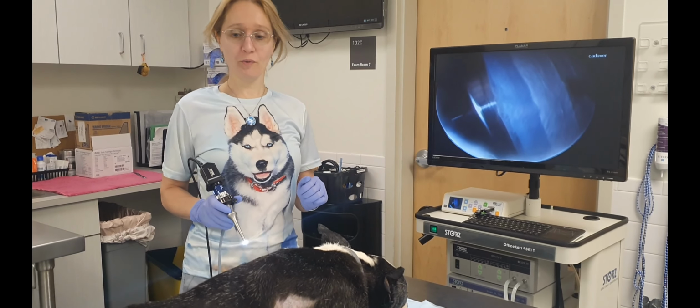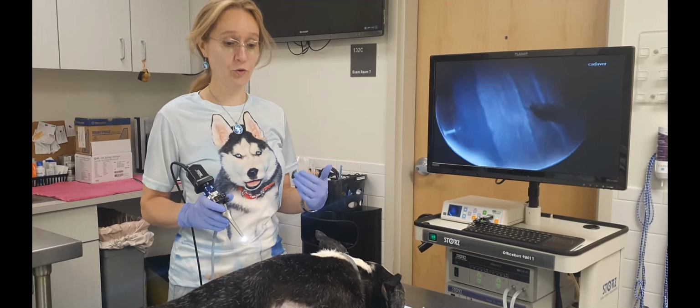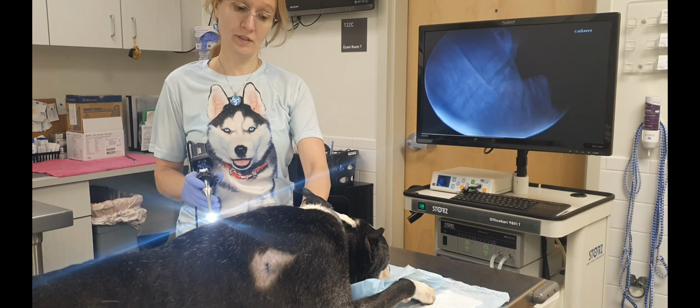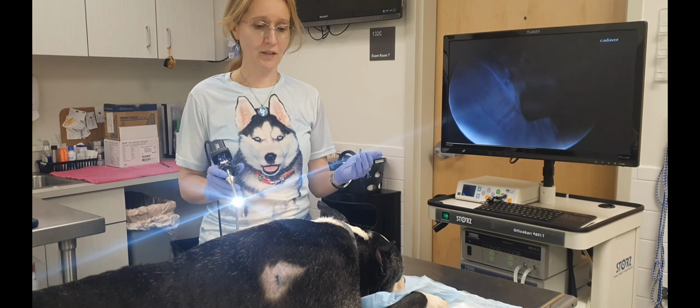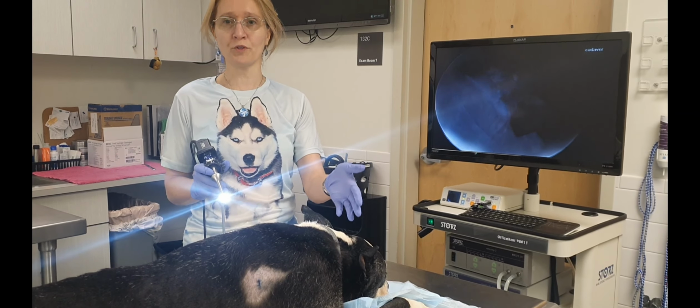Okay, so we're going to talk about positioning of the patient and positioning of the operator. The very common position is sternal, like you can see here in this dog. This is a cadaver. The benefit of that positioning is that you don't need to turn the patient during your procedures if you have to do both ears.